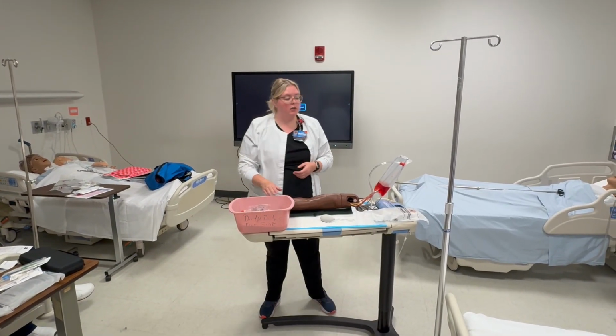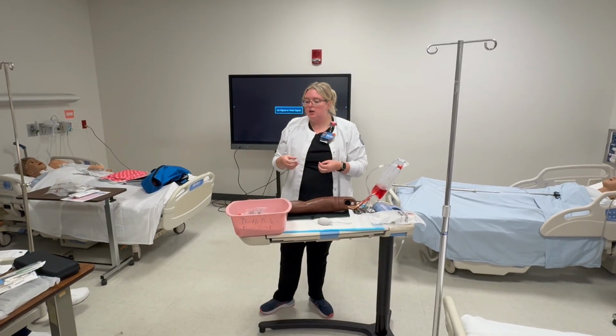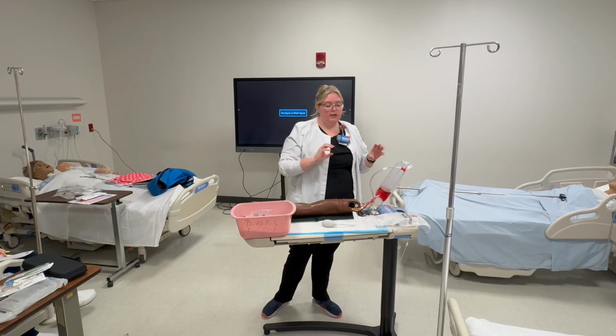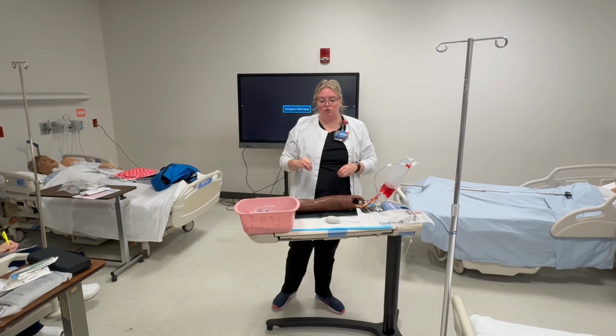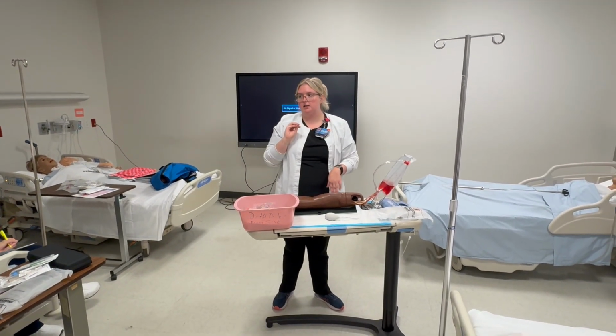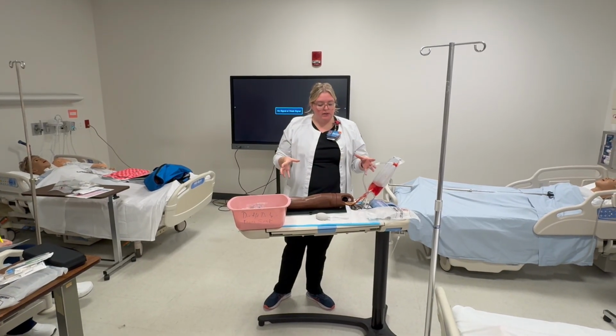We're not only inserting an IV in this, but we're also starting our primary and secondary fluids. So your order will have you pick a specific type of secondary fluid. You'll have to read your order. The secondary fluids will be there and you're going to have to select the correct one based on what your order is, okay?